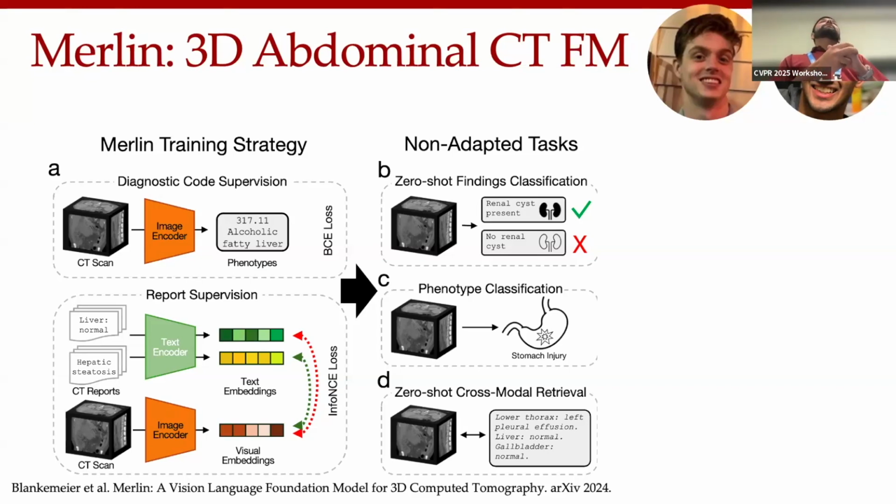And this can have a lot of implications, especially in oncology, where our oncologists and surgeons really care about finding other similar patients that they or their colleagues may have treated previously and really understand, well, this patient had this particular outcome, and my patient is kind of similar to this, so what sort of outcome might they have? So this retrieval task can really help guide future treatment.